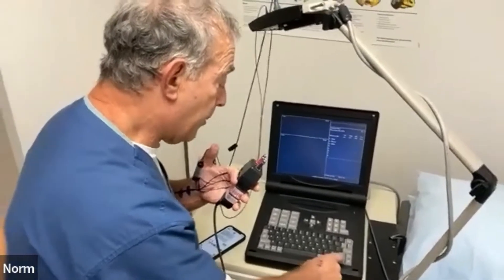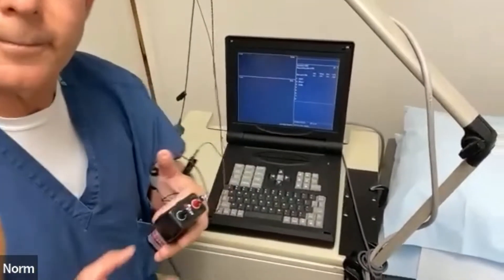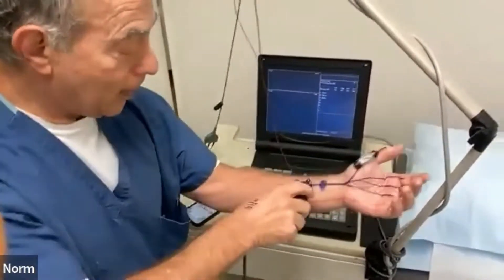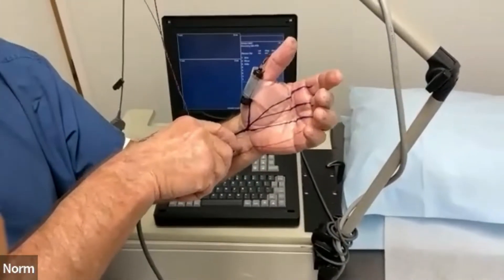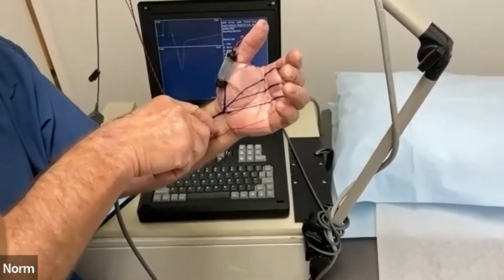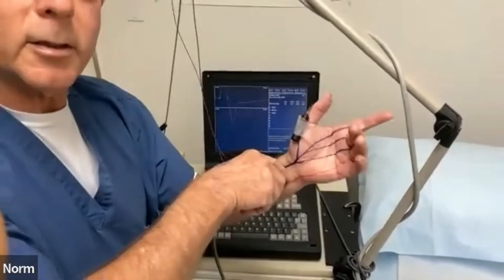I've set the parameters to study the median nerve, and I've increased the stimulation intensity to about 52.4 milliamps. I'm now going to find out if I have carpal tunnel syndrome. I'm going to stimulate this and you're going to see the twitch — or I'm going to feel the twitch and you're going to see it. That feels like a little twitch. It's not really terribly uncomfortable — on a scale of zero to ten, somewhere about a three to a six.